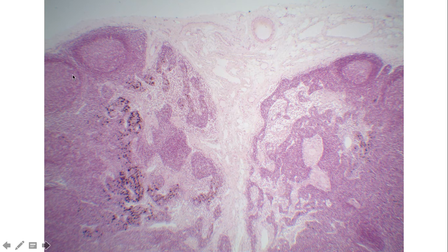And so again, here's this outer area, and it would continue around. Here we can see the cortex, the area containing these follicles, and same thing over here. And as we move in from the cortex, eventually we're going to be moving to this medulla. And again, here's an example of the medulla, this area that doesn't have the follicles, and it has these stringy looking layers of cells. And as this is moving in, this fluid eventually is going to leave this lymph node at this indentation. And so this is a nice close-up of one of the hilus.